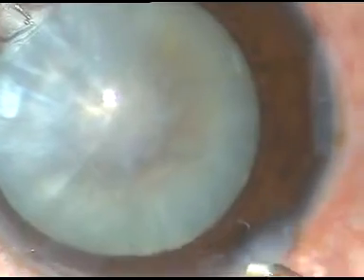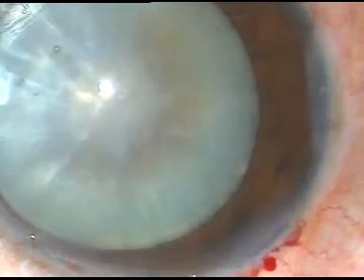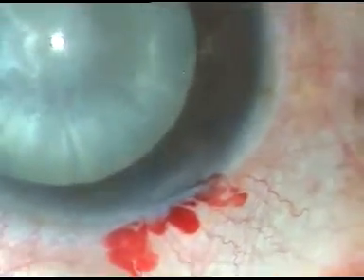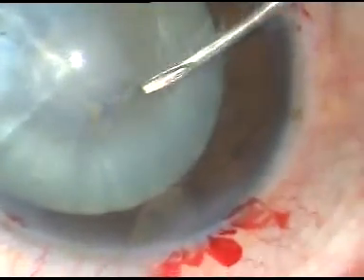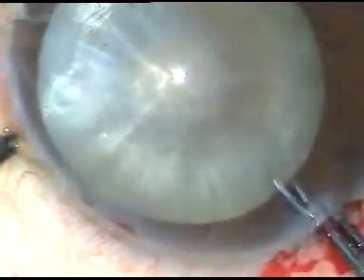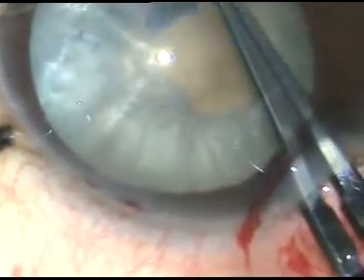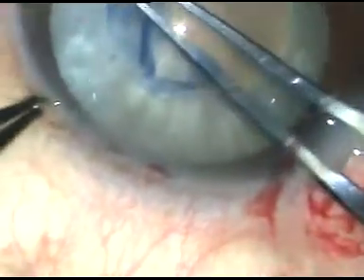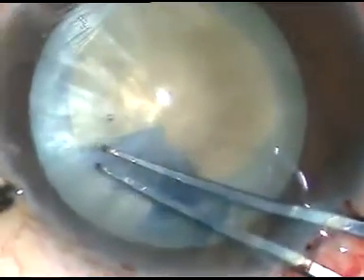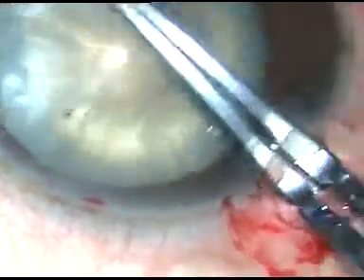This is the second case. The capsule has been stained. In this case I have made two side ports. Now the capsule is being incised with the same 26-gauge bent needle, and I am going to take utrata forceps. This capsular tag is held with utrata forceps. This is a non-intumescent cataract, and in such cases I can do an adequately sized rhexis at the first attempt — I don't need to do two-stage rhexis.